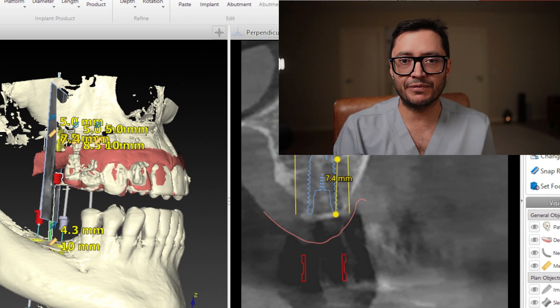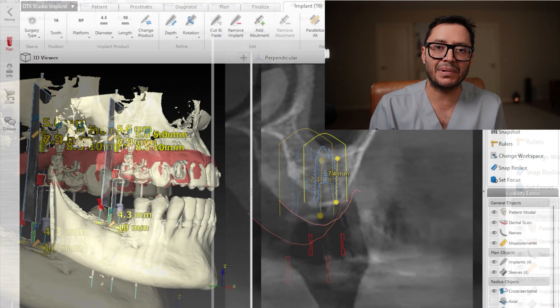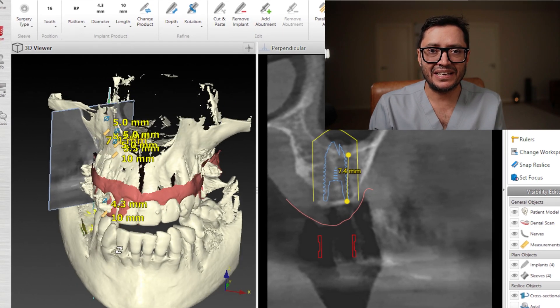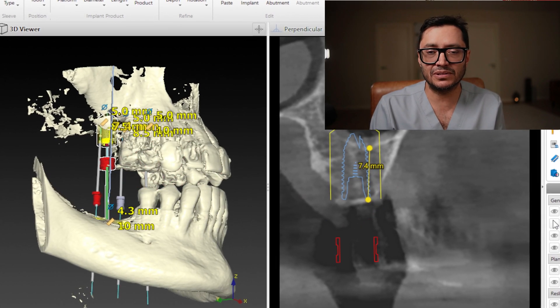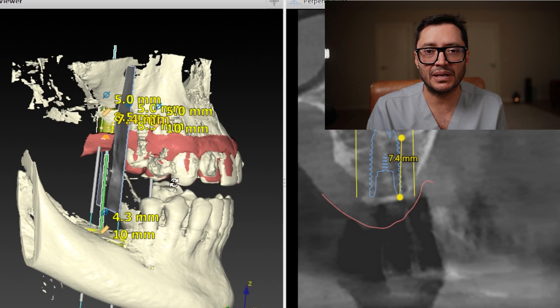First, we start with the planning. This is a young female patient in her 30s, no known morbidities. She comes to the clinic for oral rehab of the first, third, and fourth quadrants. Although we did the complete surgical process in one go, I wanted to show a complete step-by-step process for one implant, as the rest is the same. We're working with DTX software. We can see here that we have around eight millimeters of bone, nice, clean, septum-free sinus. We plan a 4.3 by 10 millimeters implant, and I think it should go pretty well.